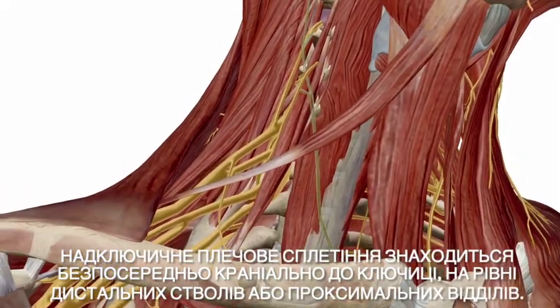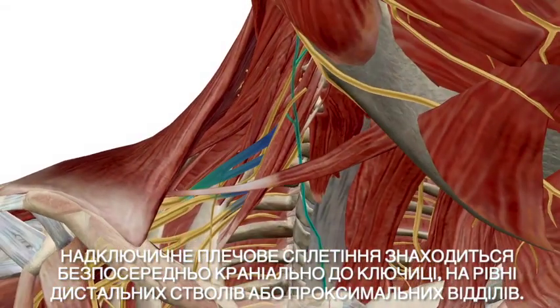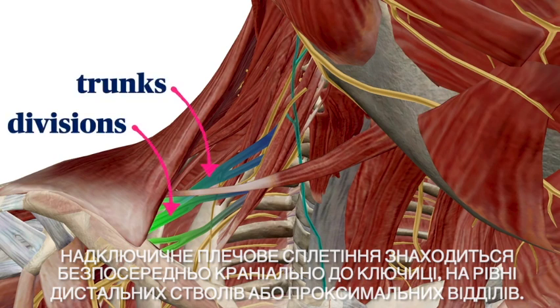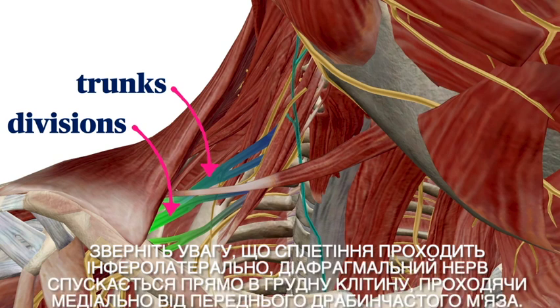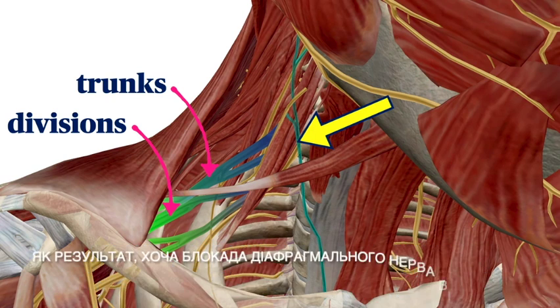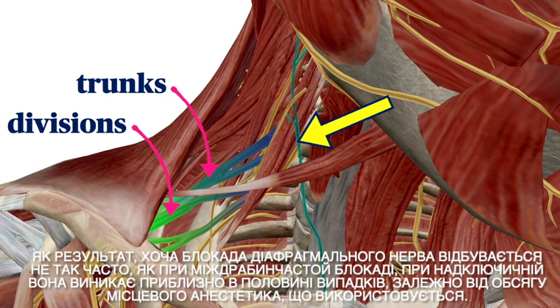The supraclavicular brachial plexus is approached just cephalad to the clavicle at the level of distal trunks or proximal divisions. The plexus is packed tight in this region between the first rib and the clavicle, making it a convenient location to anesthetize the entire upper limb with one injection. Note that as the plexus travels inferolaterally, the phrenic nerve continues straight down into the chest by traveling medially off the anterior scalene muscle. The result is that while phrenic nerve blockade is not as frequent as with interscalene, it occurs in up to roughly half the time with supraclavicular, depending on the volume of local anesthetic used.